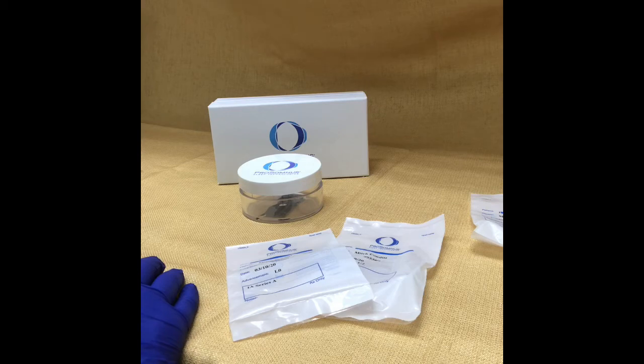And that's it — pretty easy to adjust your Prosomnus appliance. Just give us a call if you have any questions. Thanks so much.